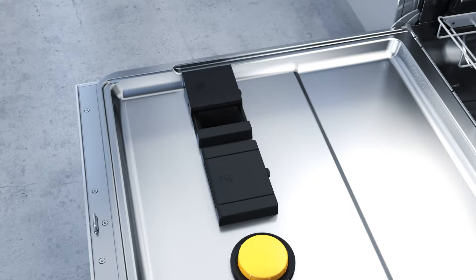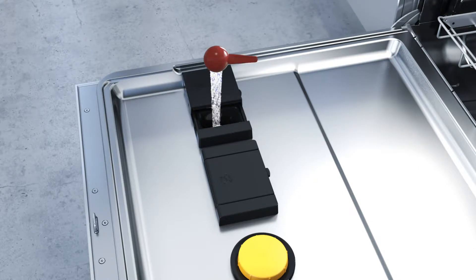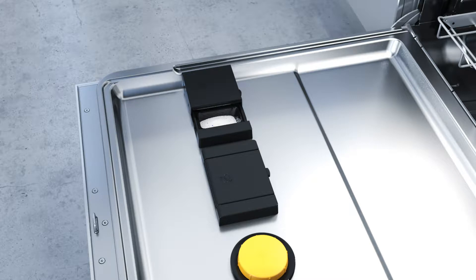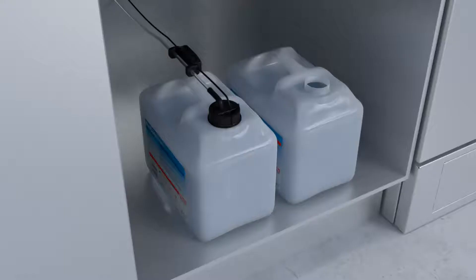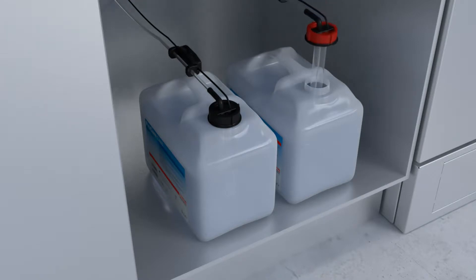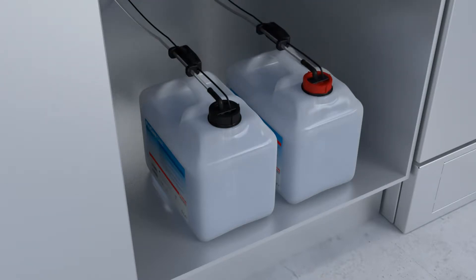ProCare Dent chemicals ensure top class results and allow users a choice of powder or liquid products. Machines, their programs and the chemistry involved are perfectly matched. Automatic dispensing and correct volumes are guaranteed when the machine is connected to liquid dispensing systems.